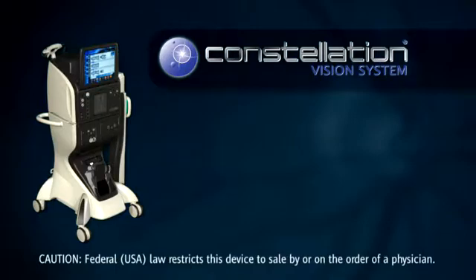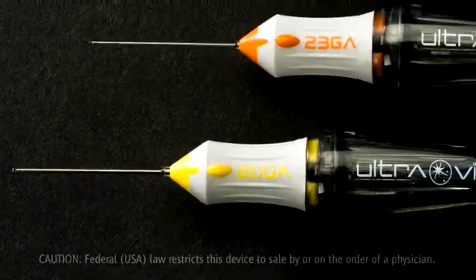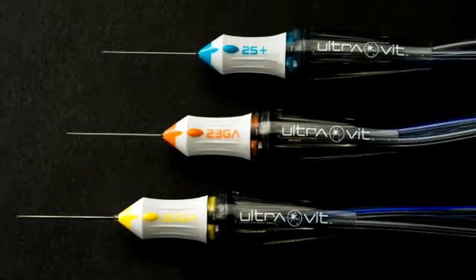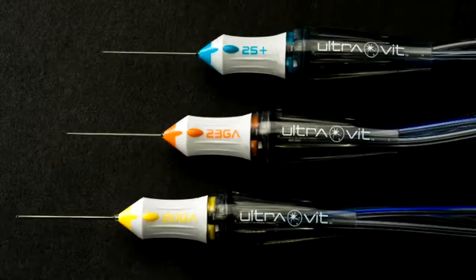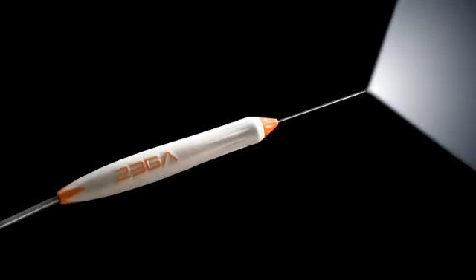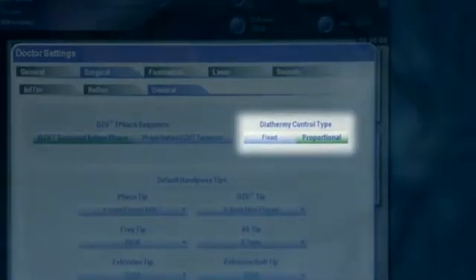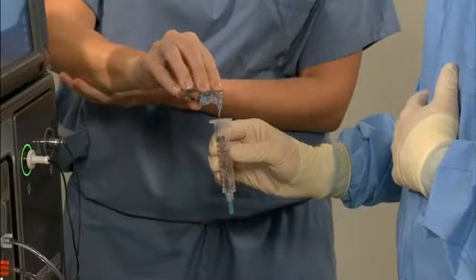The Constellation System posterior segment functions include 20, 23, and 25-gauge vitrectomy at 5,000 cuts per minute, posterior segment illumination using the latest Xenon technology, maintenance of a desired surgical intraocular pressure with IOP control, and proportional diathermy.